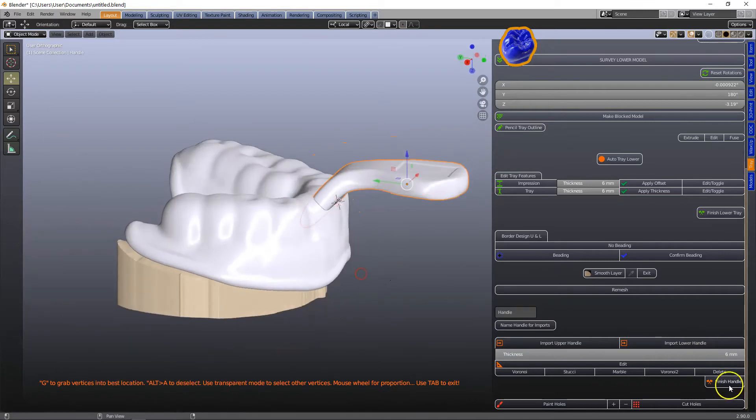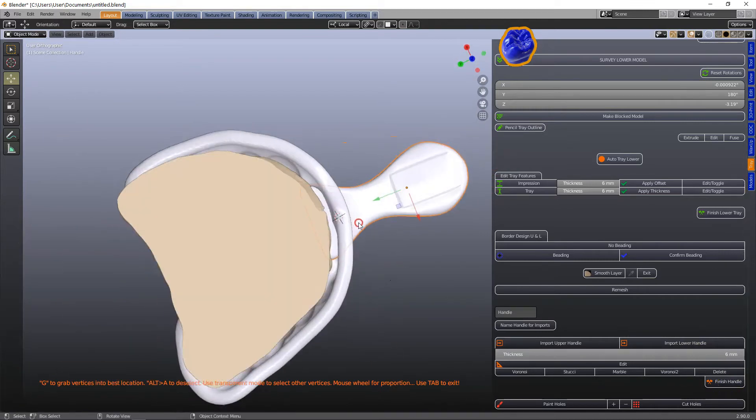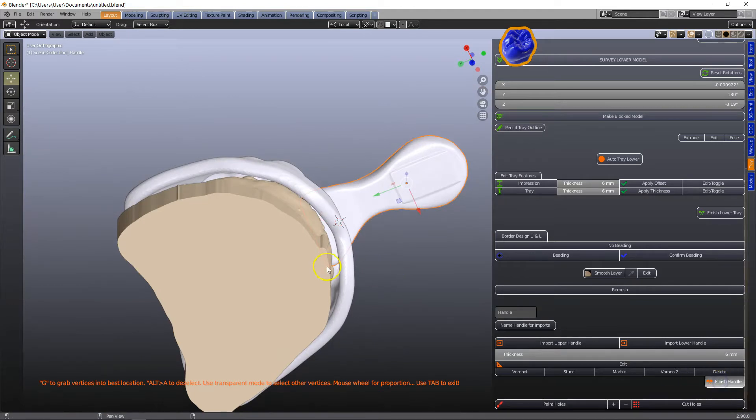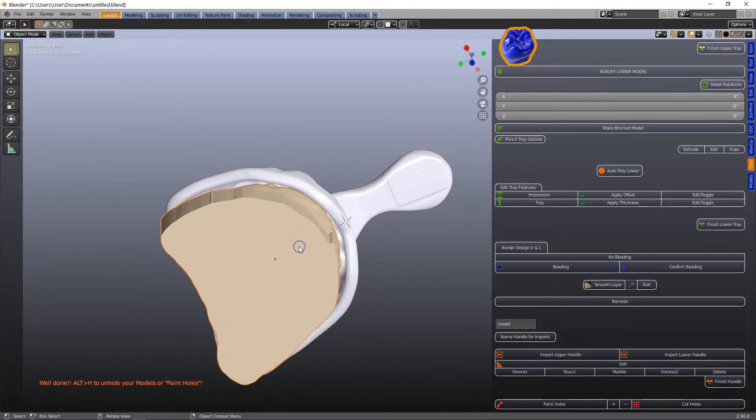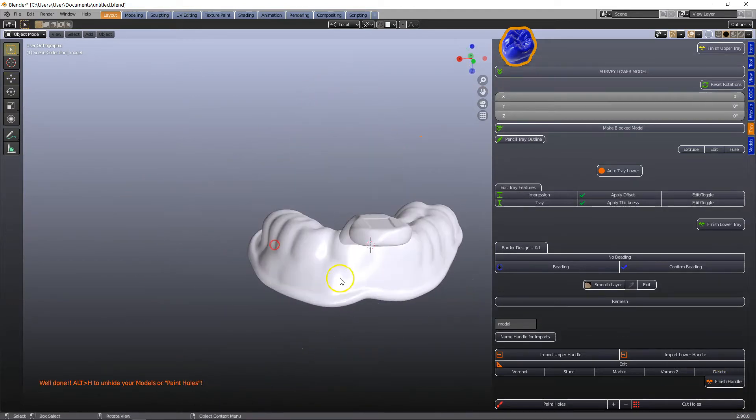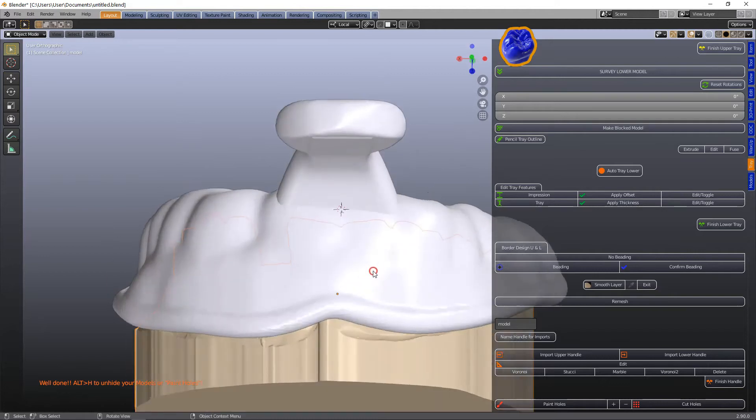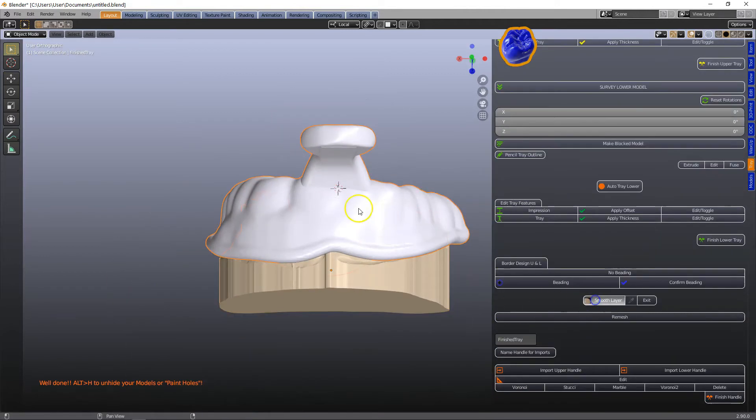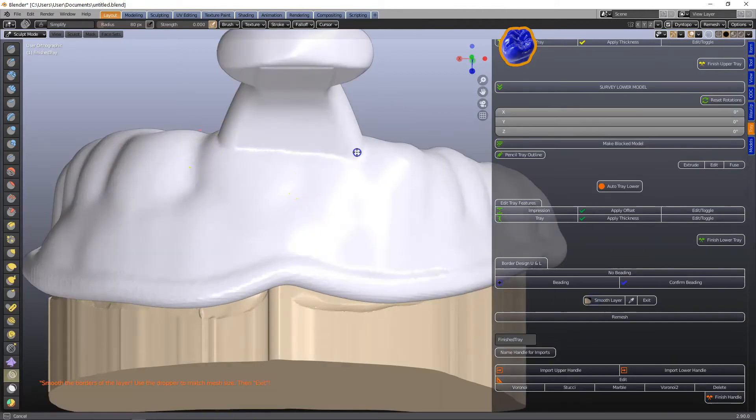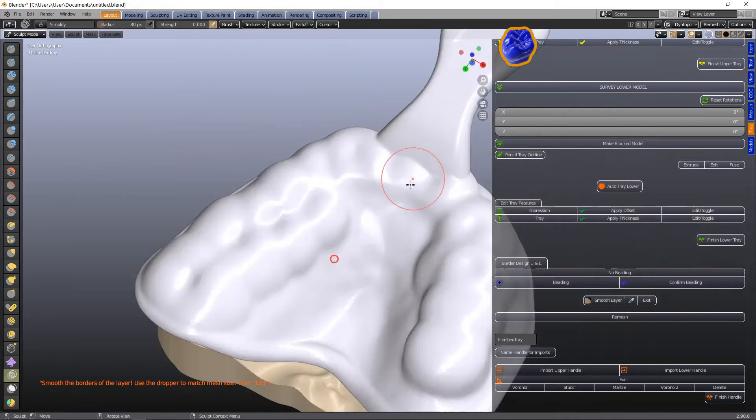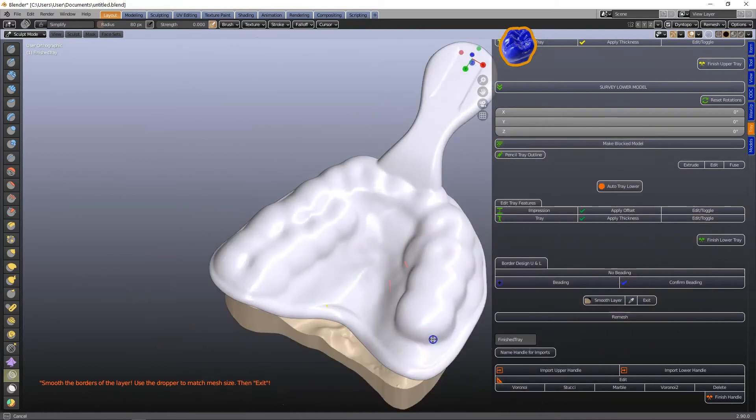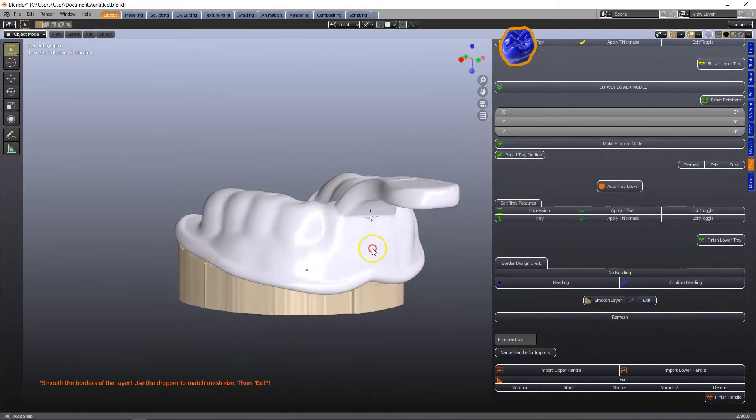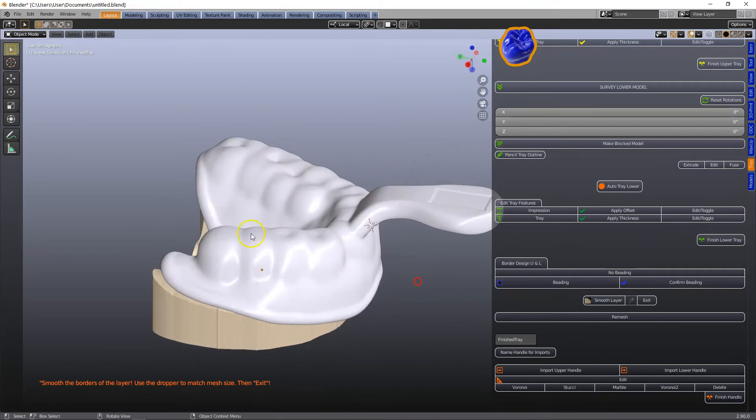Note that the tray extrudes through the handle but when we click on finish handle it will cut it off. Following this we can smooth that even more. It's not mandatory to do this but if you want to be precise you can do it and then exit.